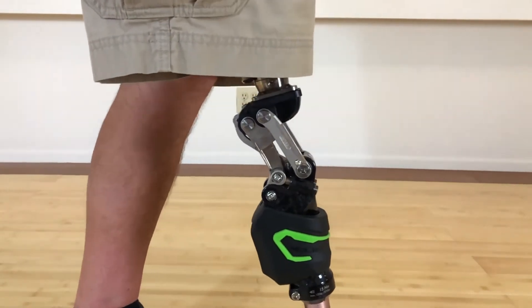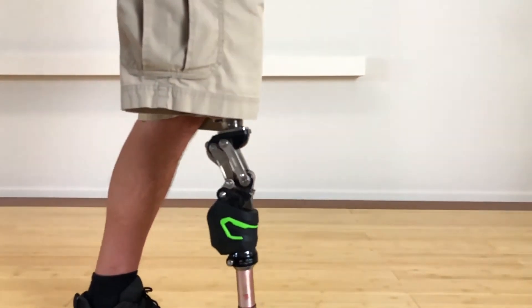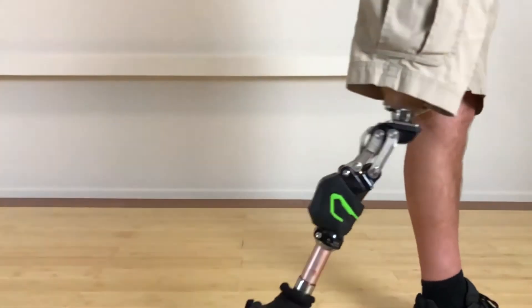Once the custom ICR setting has been adjusted, the stance flexion setting can be adjusted. The SLK Multimatrix provides up to 15 degrees of stance flexion cushion at heel strike.